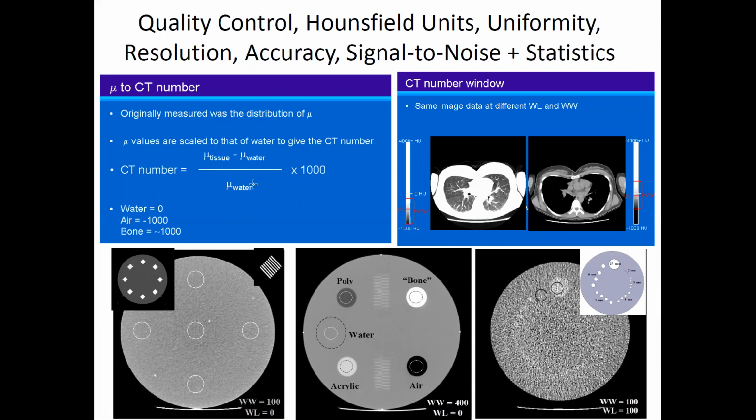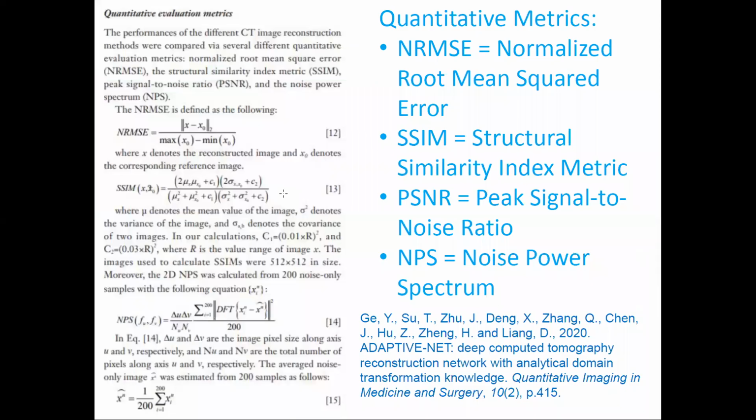And it's just an interesting aside, I should have caught it when we talked about the history. CT was originally invented as an adjunct to radiation therapy for radiation treatment planning. It was going to be your input for calculating what your beam was going to be doing. So for that purpose, it's all okay. The CT number has been around since then. Hounsfield units, Hounsfield, the guy we saw on that earlier slide.